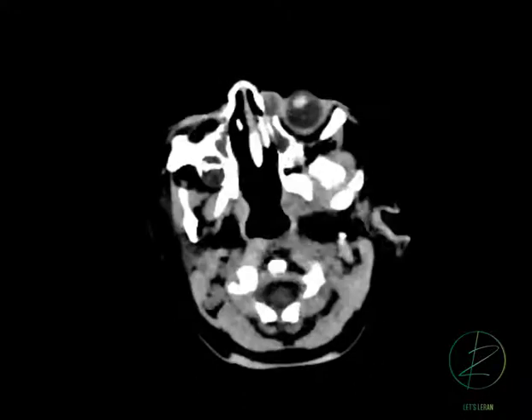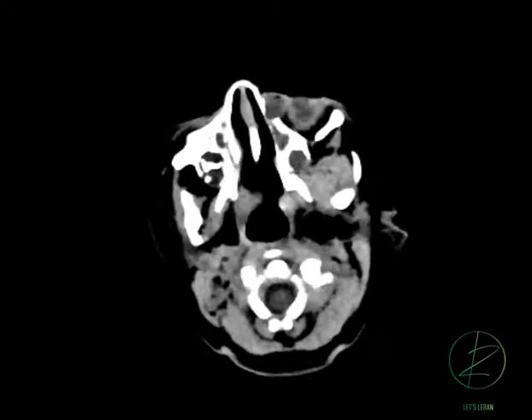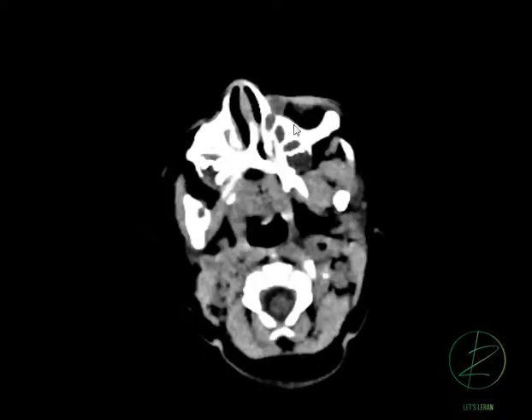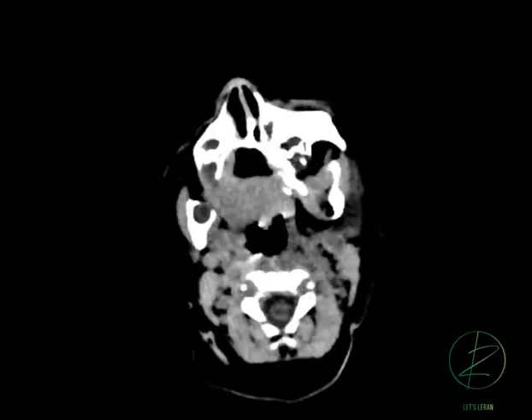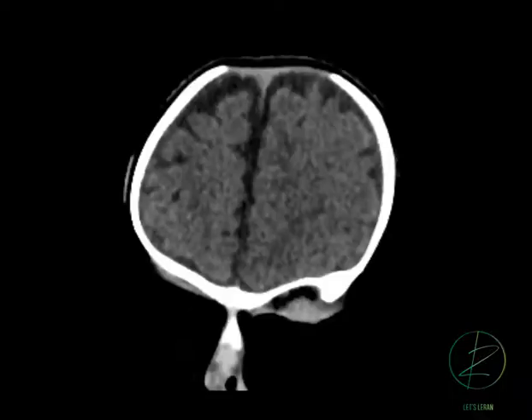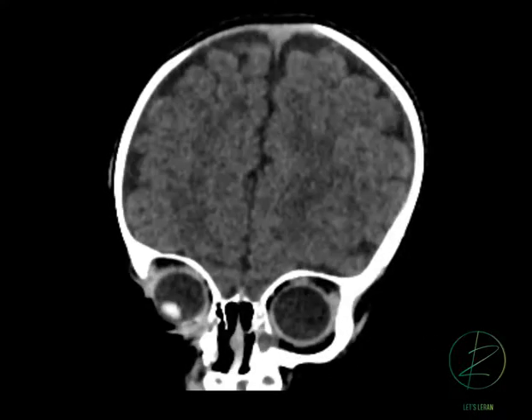This is a rapid review of a case where a patient presents with a swelling along the left medial canthus. You can see that along this medial region there is a cystic area which is extending inferiorly through the lacrimal duct, up to the inferior meatus region. In the coronal view, you can also appreciate the same cystic lesion along the medial canthus on the inferior side.